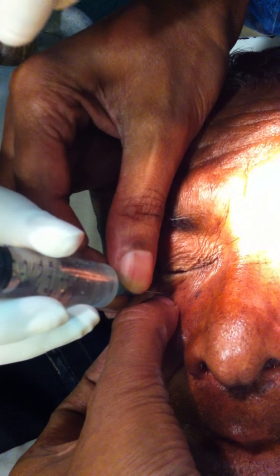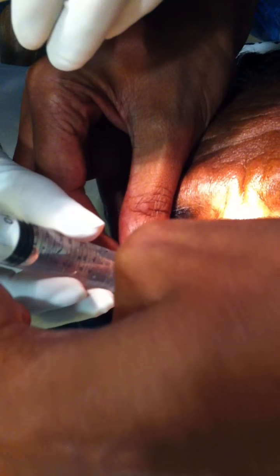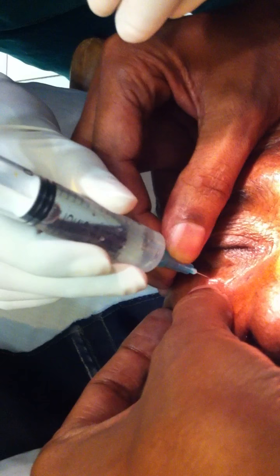Push slowly. You touch the bone there — see? See, you scraped it — see there?